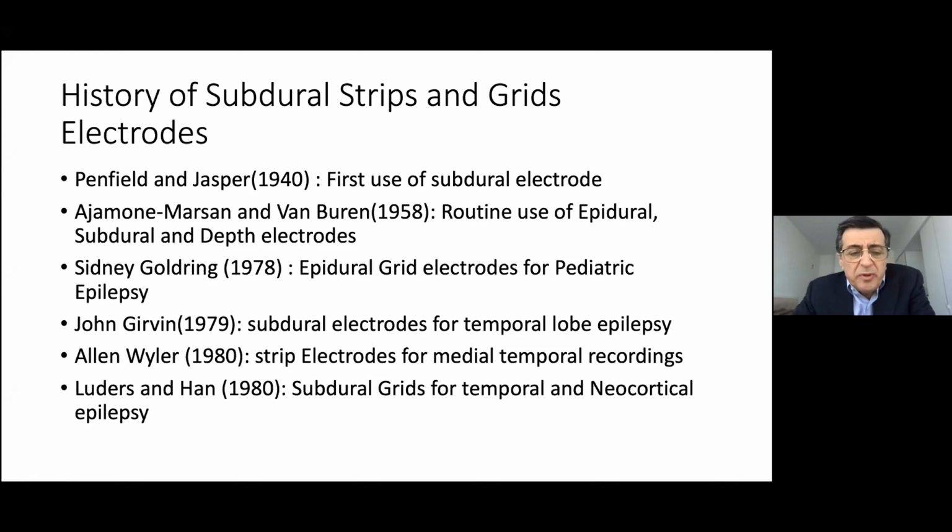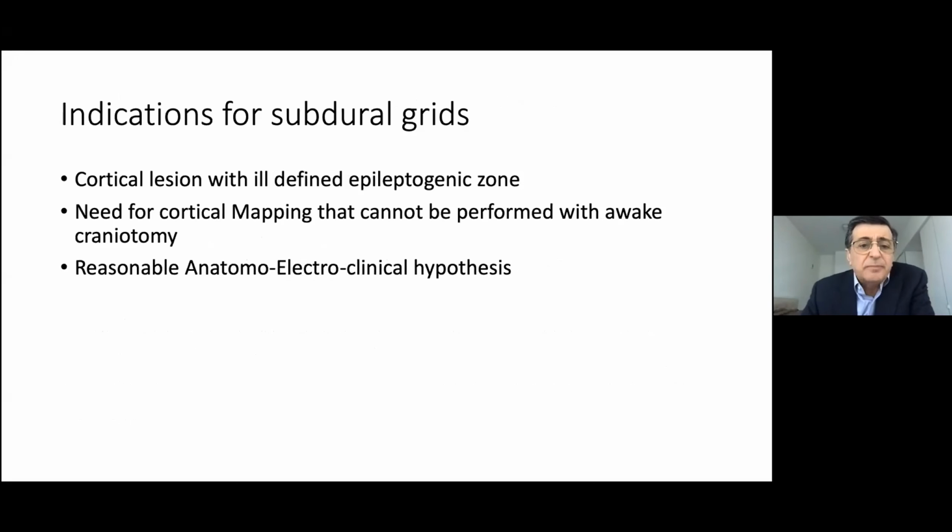And then a group of people, Alan Wyler, John Gervin, and others at the Cleveland Clinic used subdural grid electrodes for invasive monitoring. And this started almost like the American school of invasive monitoring that was different from the European school that Chico very elegantly demonstrated.